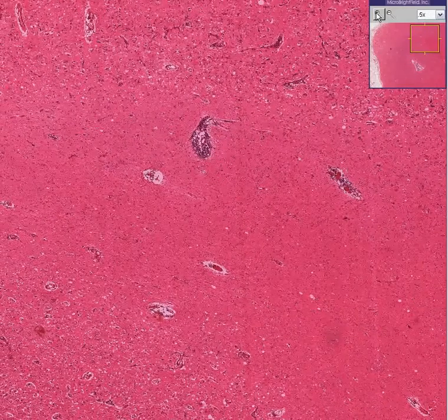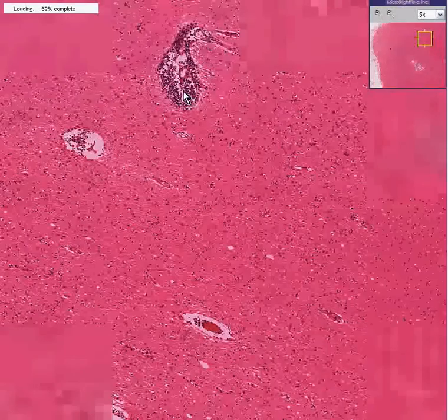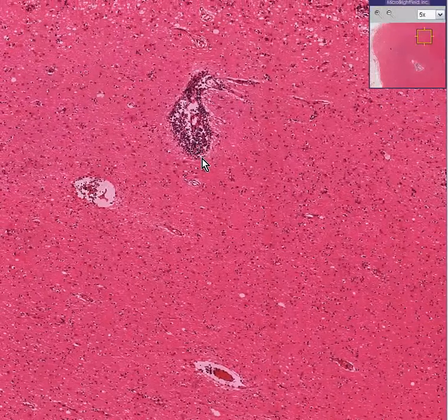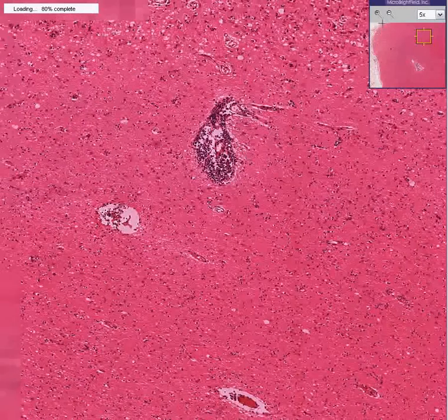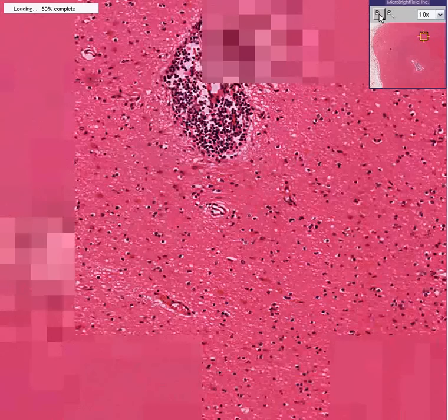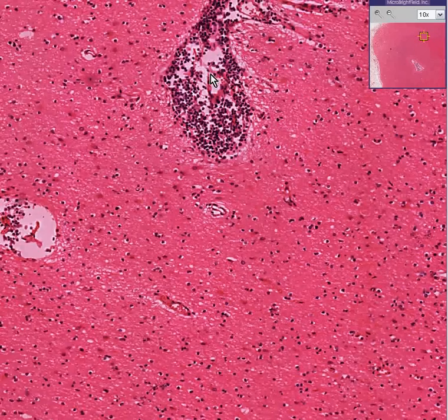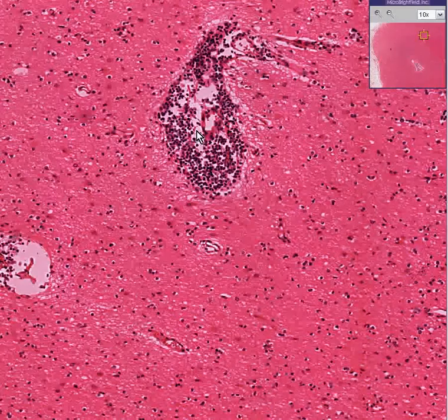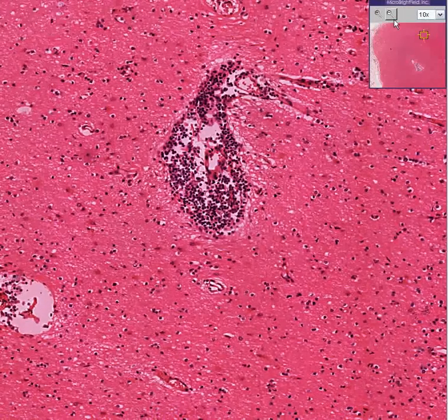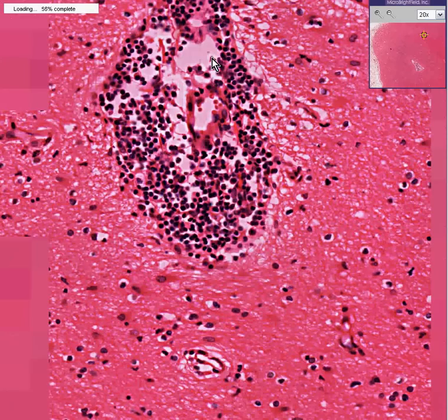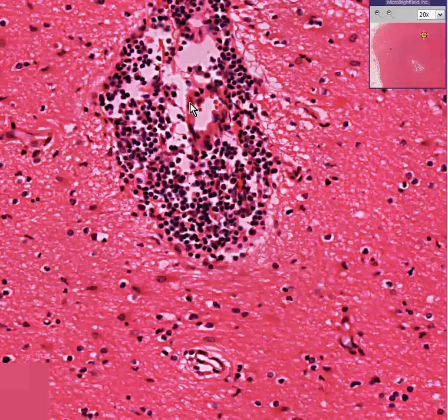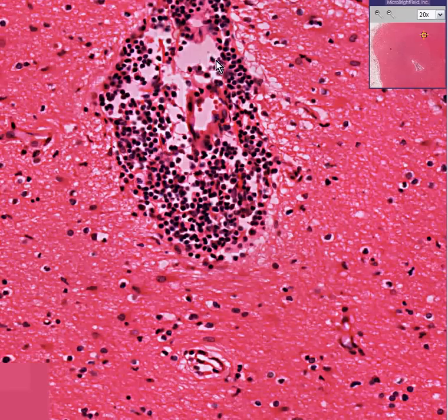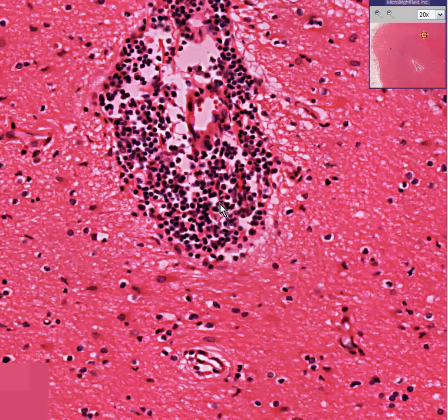This is a very, very, very common and often routine hallmark feature of an encephalitis. And although it is most characteristic of the viral encephalitis, in this case, we could see cuffing of this blood vessel by these lymphocytes in the theoretical or potential space. It's called the Virchow-Robin space of the brain.